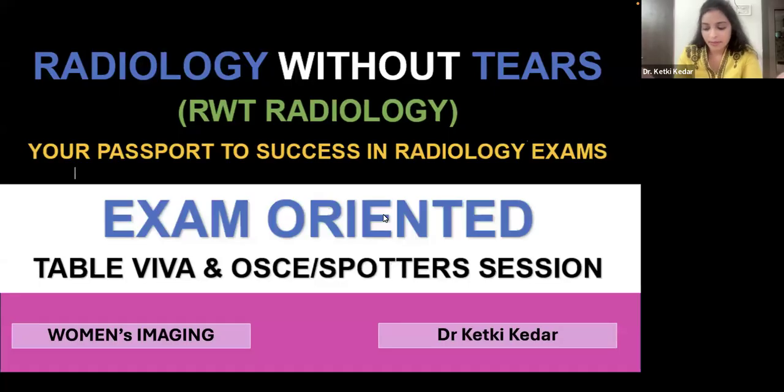So I have come up with a mixed bag which is full of spotters, starting from breast imaging to fluoroscopic imaging, and then will be followed with the cross-sectional imaging, which will comprise of the gynecological as well as a few spotters of fetal imaging.